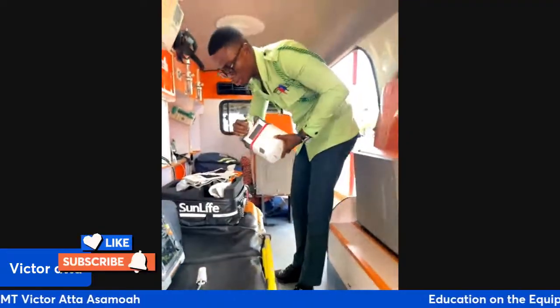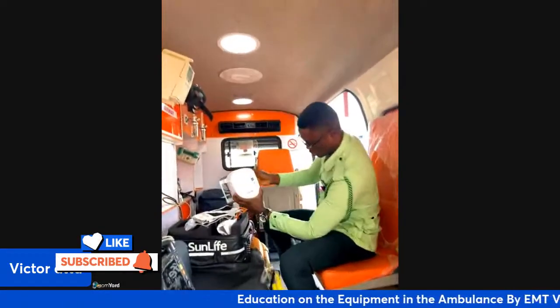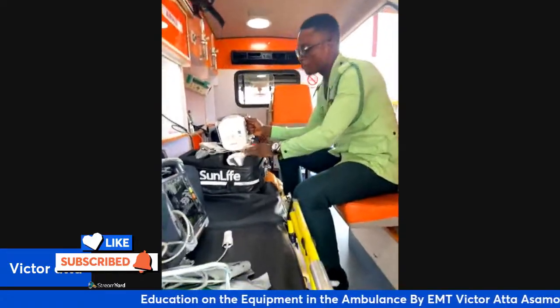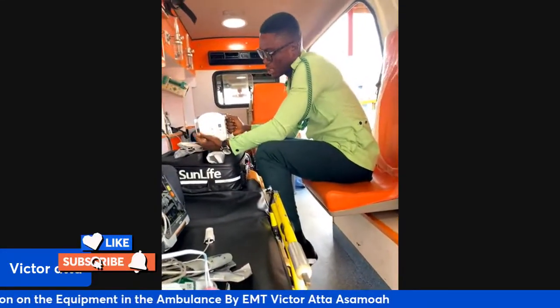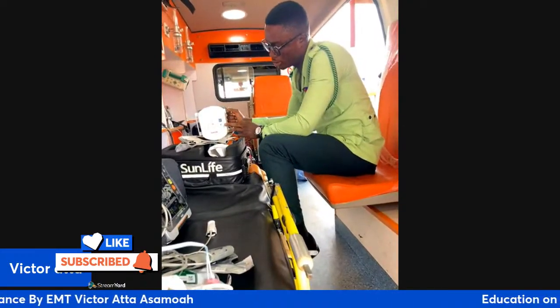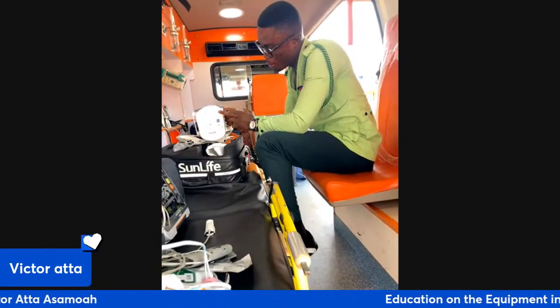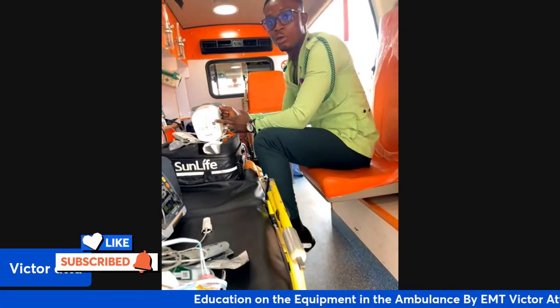As you can see, we have a sign of a body on it, and then we have the power button, and we have how you're going to deliver your compressions.